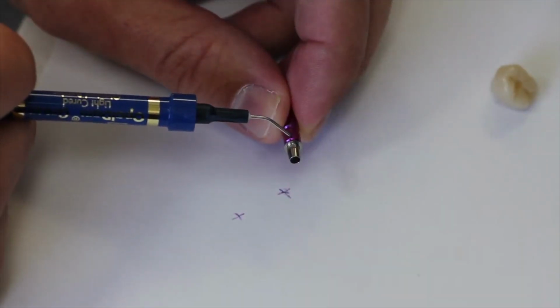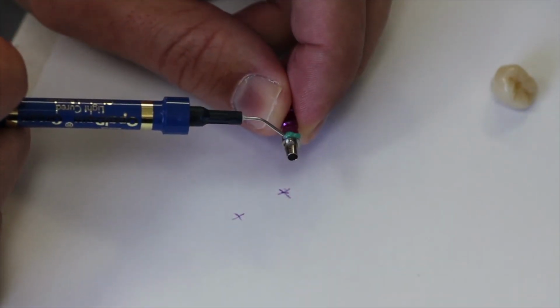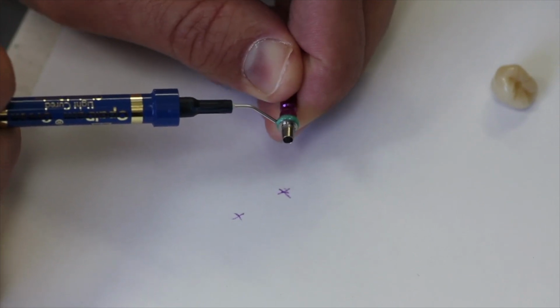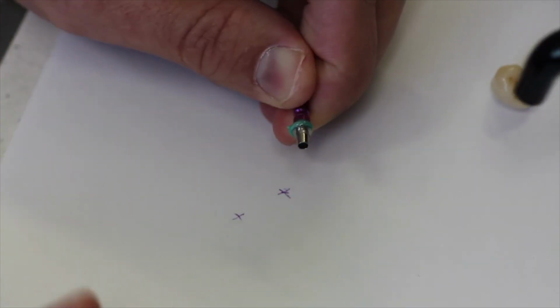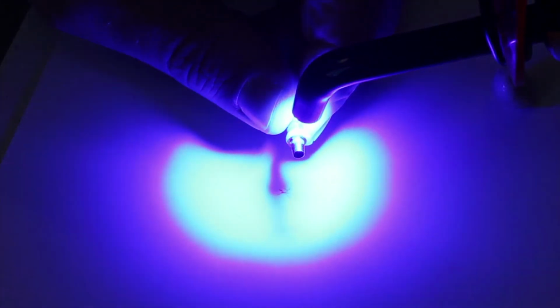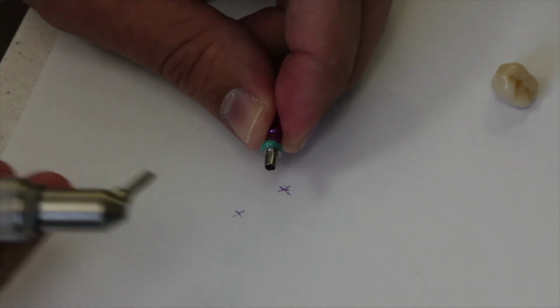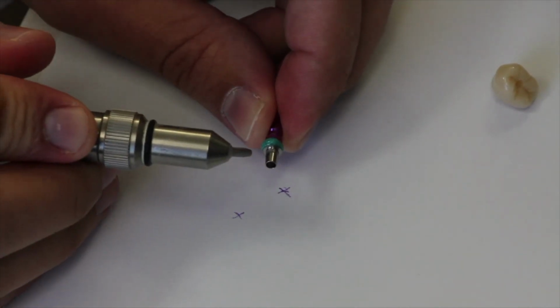Before sandblasting the titanium base, you need to block out the emergence profile using a wax, or in this case I used a liquid dam. Once you have blocked it out, in this case with a liquid dam, I go ahead and light cure. When this is complete, I can now begin sandblasting the titanium base.